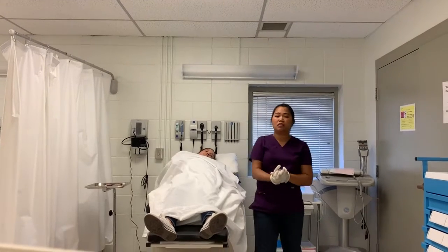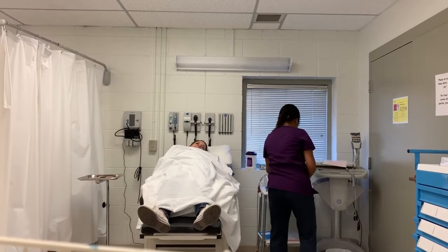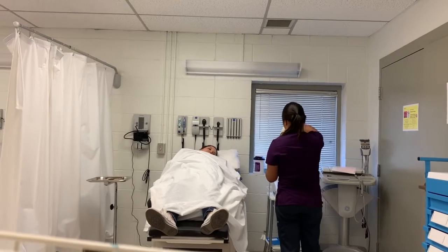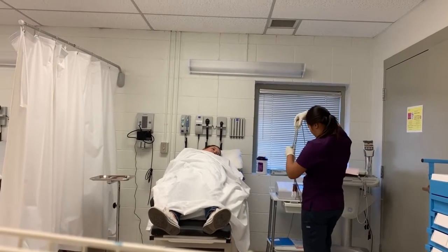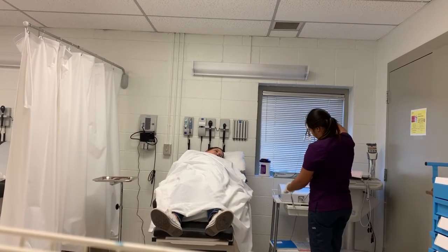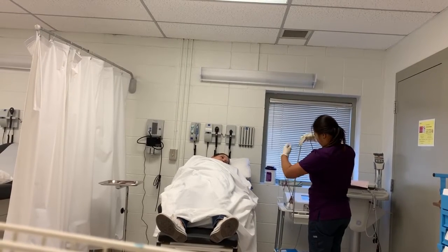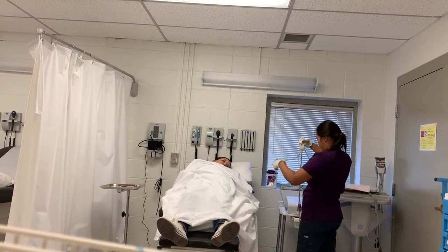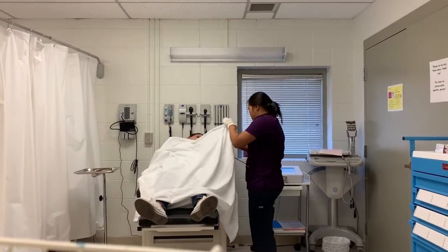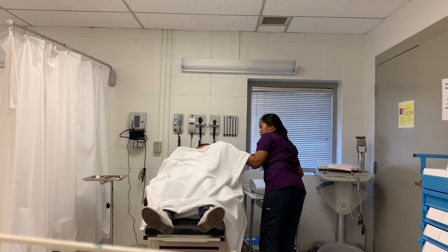Okay, now that I've placed all the electrodes, I'm going to go ahead and proceed to the lead wires. I'm going to place the lead wires on it and work under the sheets.